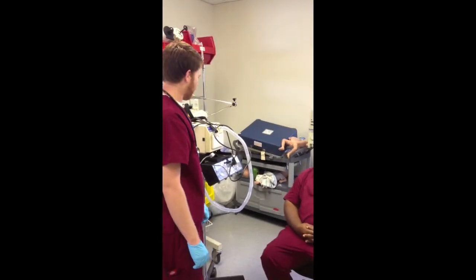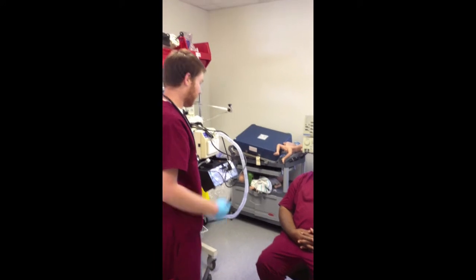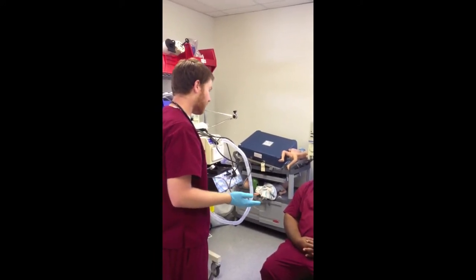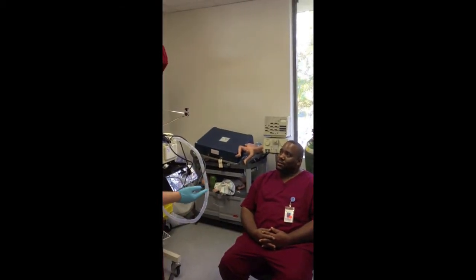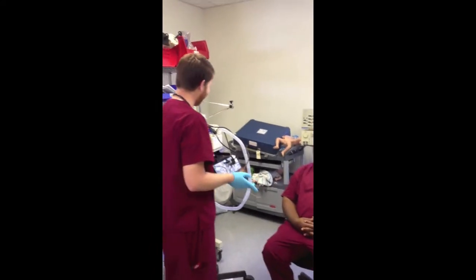Next, explain the procedure in layman's terms. BiPAP stands for bi-level positive airway pressure and will assist you in breathing. It helps to keep the airway open and the lungs inflated. The idea is to give you a boost on the inhalation so you have more air in the lungs and thus take a deep breath.